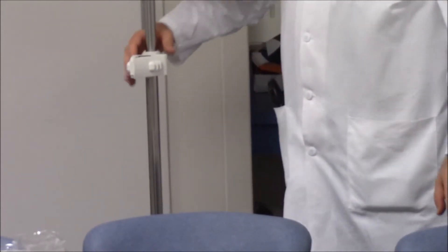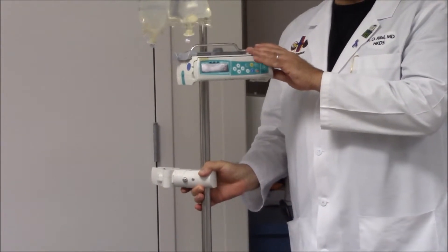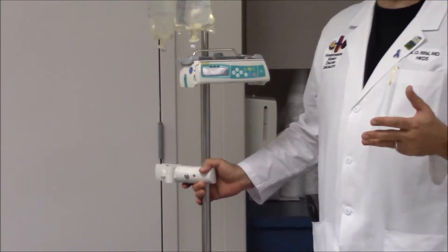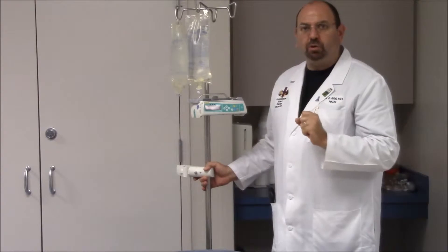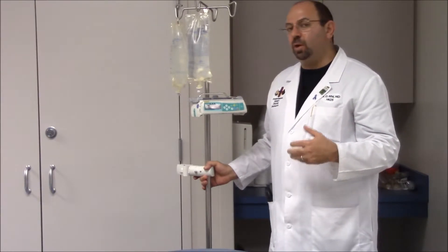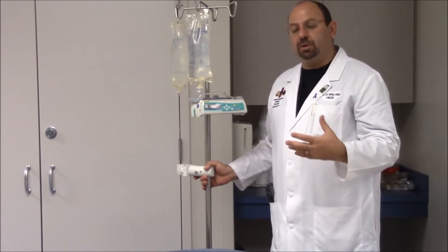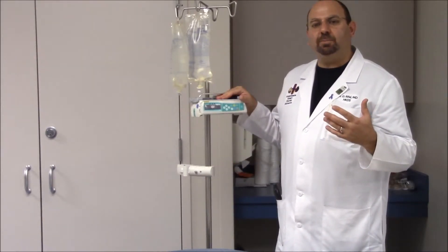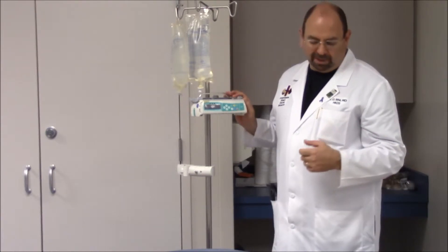We will also need IV pumps. We need three pumps if using heparin drip, bicarbonate drip, and saline replacement as the CVVH process continues. If using only peritoneal dialysis fluid, we need only two pumps — one for heparin and one for peritoneal dialysis infusion as replacement fluid, which also eliminates the need for separate saline, bicarbonate, and calcium. So two pumps for peritoneal fluids, three pumps for heparin, bicarbonate, and saline.